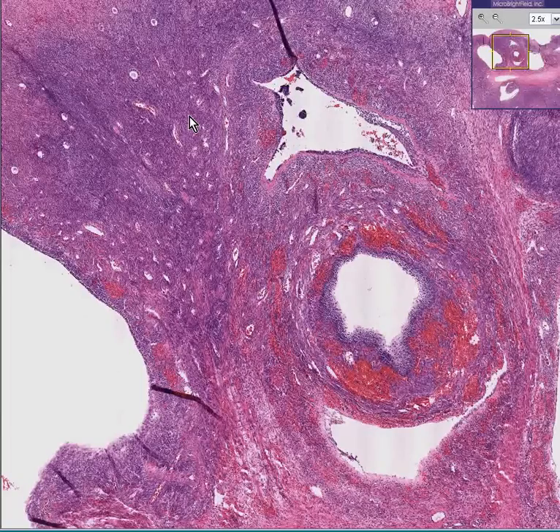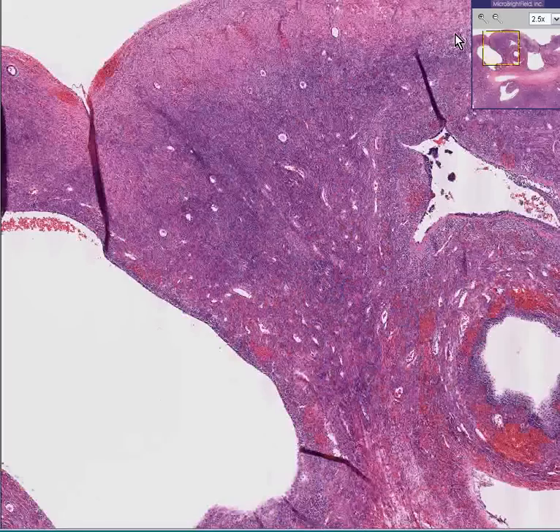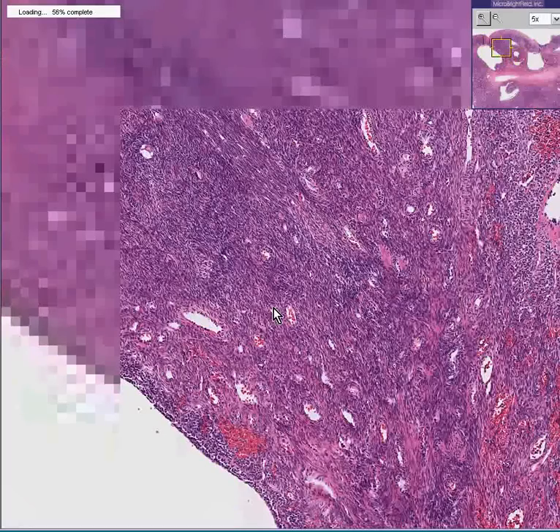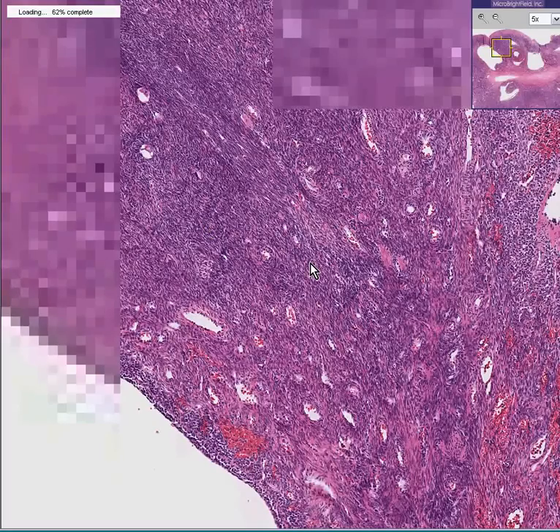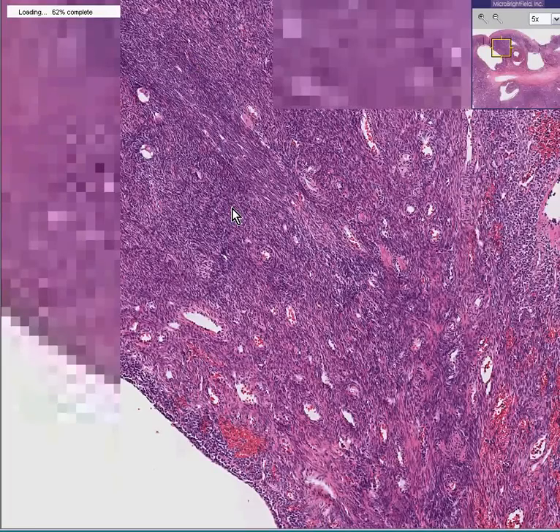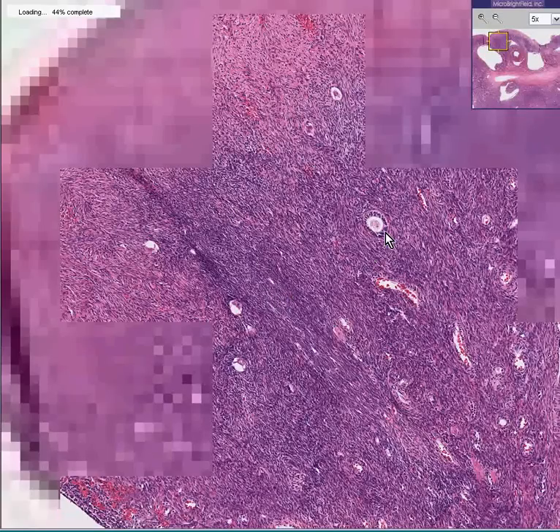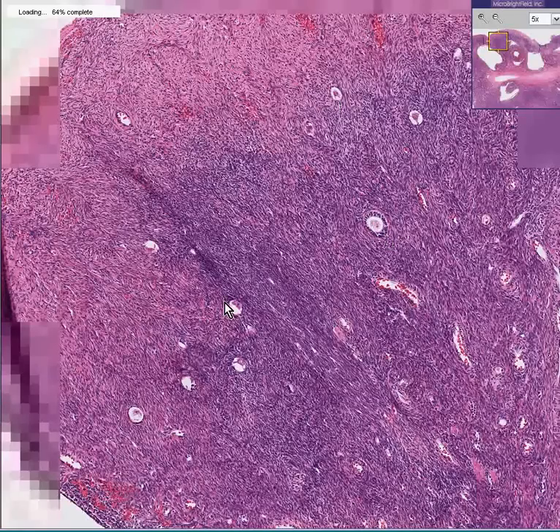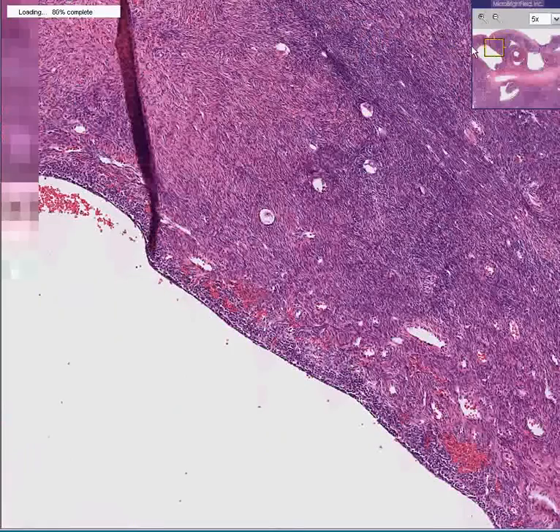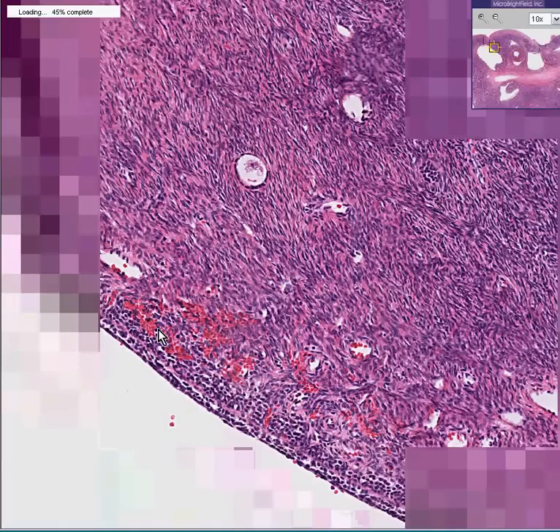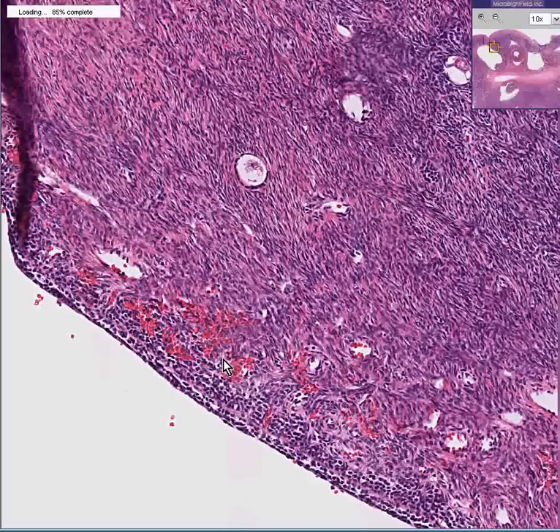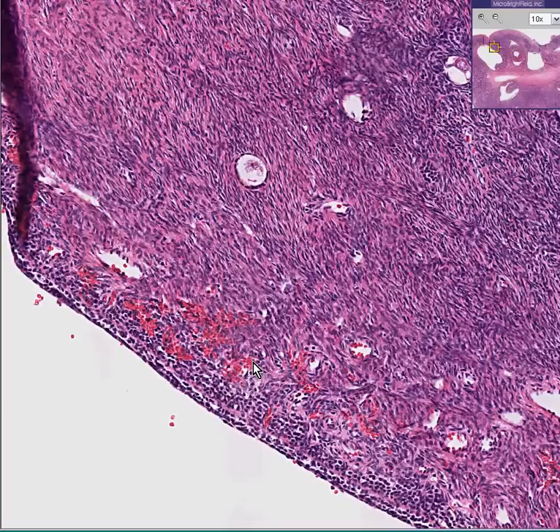If you notice, the cysts look a lot like the cysts you'll see in a developing follicle. There are some theca cells at the periphery. You can also see that in the ovarian stroma itself, you're going to see some what look like normal primary-looking or primordial cysts. But as they develop, they just don't look like they have enough granulosa cells. Although you can appreciate that there are some thecal cells along the surface, both interna and externa. This is a typical Stein-Leventhal or polycystic ovary appearance microscopically.